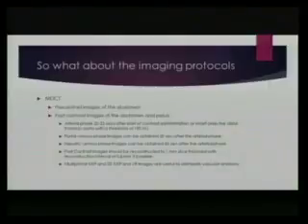Then post-contrast images of the abdomen, you're going to need an arterial phase at 20 to 25 seconds after the start of contrast administration, or you can do a smart prep of the distal thoracic aorta at about 180 Hounsfield units as your threshold. And then you do a portal venous phase 20 seconds after the arterial phase, and a hepatic venous phase 60 seconds after the arterial phase. And you need to use very thin slices and do multiplanar reformats of all of the post-contrast images.